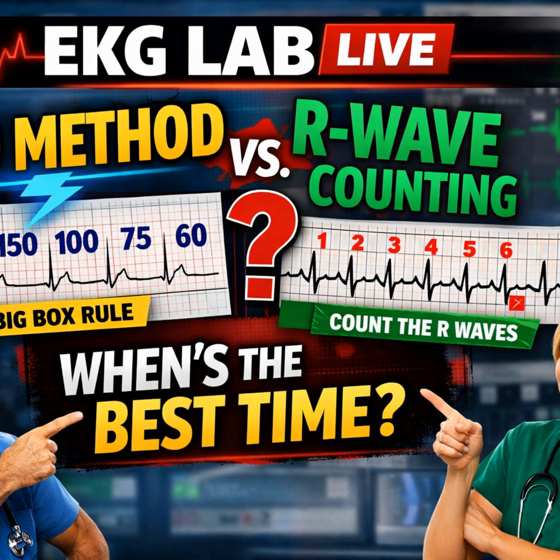But if I force myself to use the big box method, and I measure that interval, and I get exactly 150, I can't ignore that number. Math is stubborn. It overrides my bias. It forces me to stop and ask, wait, why is it exactly 150? Could this be atrial flutter? The rigor of the calculation protects me from the softness of the clinical history.